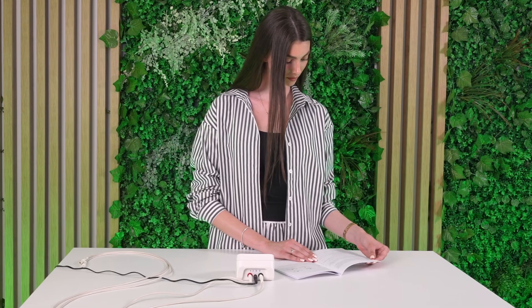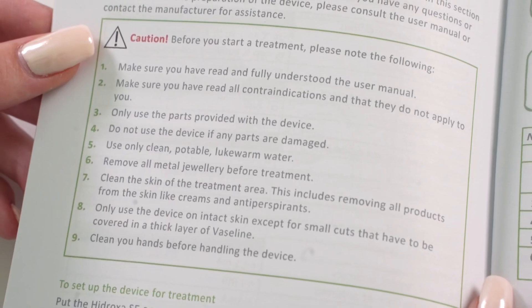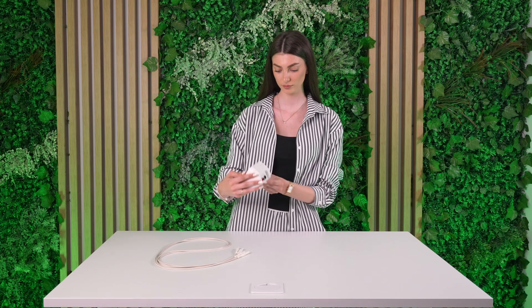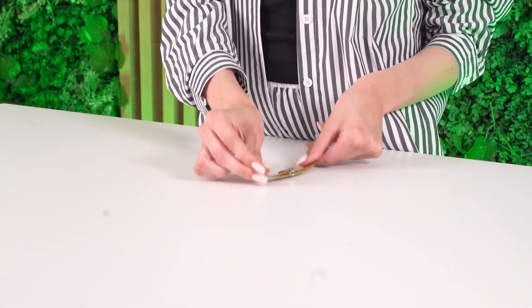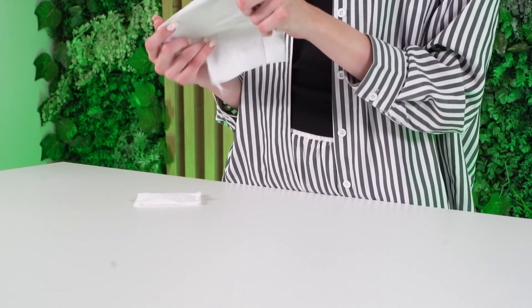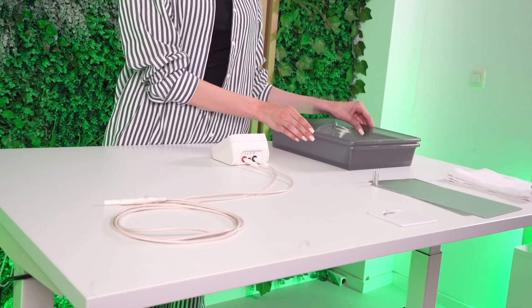Before starting, confirm you've read the instructions for use and don't have any conditions listed in the contraindications, like a pacemaker, pregnancy, or skin damage. The device and cables are clean and undamaged. All jewelry is removed. The treatment area is washed and free from creams or deodorants. If you have small cuts, cover them with Vaseline. Use clean, lukewarm tap water. Place the device on a stable surface. You're ready to begin.